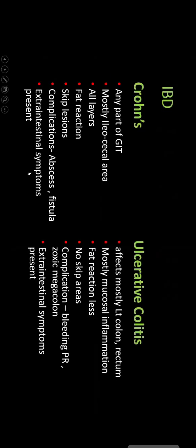We may appreciate mural hyperemia, particularly mucosal and submucosal hyperemia. Less transmural involvement, so less pericolonic inflammation. So pericolonic findings are less common. Pericolonic, mesocolonic thickening is less common in ulcerative colitis, but it is very common in regional ileitis or Crohn's disease. So these are salient points.